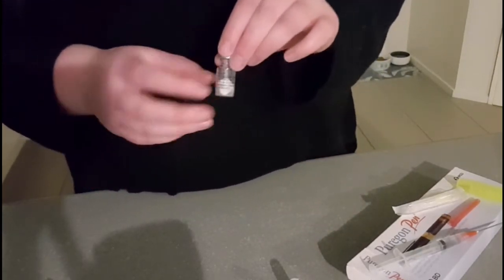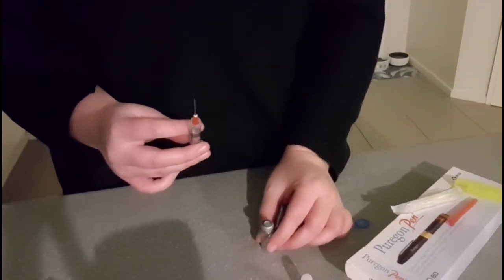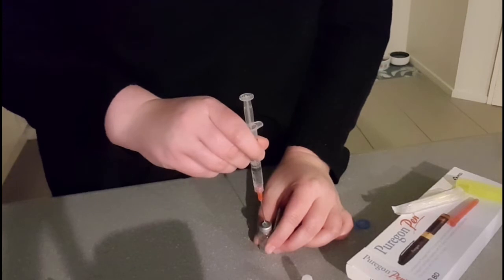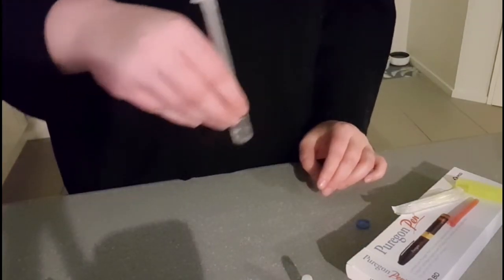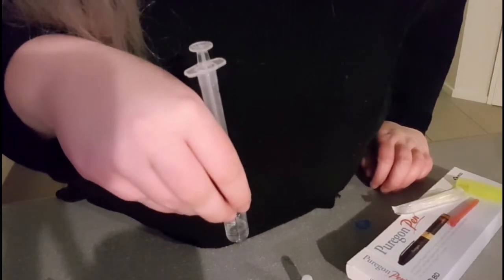Then you get your little powder mix — so we've got the cap off. We have that, and then we have this — oh, good. The liquid's already gone down itself. Just give it a swirl. I'm scared. You have now mixed one vial of Menopur.